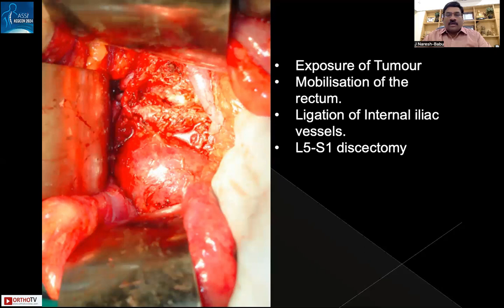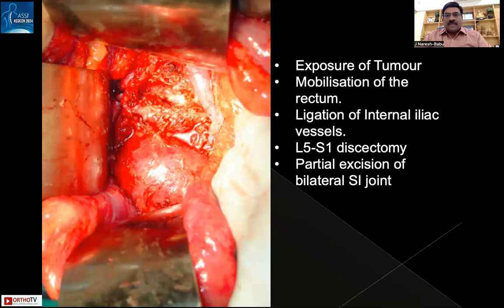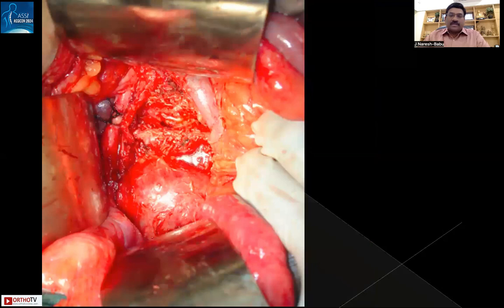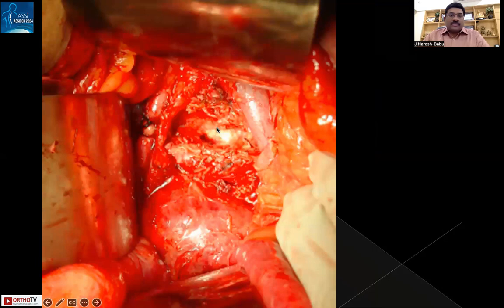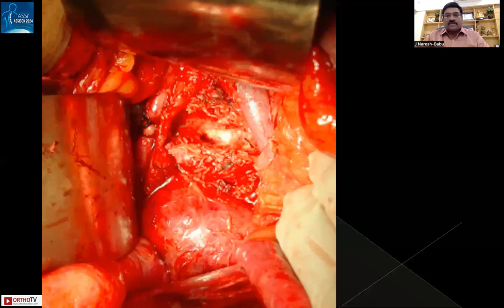To remove the sacrum en bloc, an L5-S1 discectomy is performed anteriorly along with partial excision of the bilateral sacroiliac joints, making the posterior excision easier. Here you can see the discectomy being performed, and the ligated internal iliac arteries and veins on the left side; similar steps are followed on the right side.